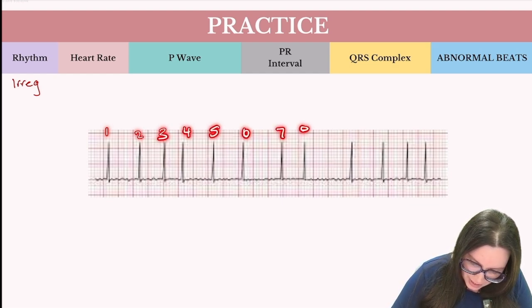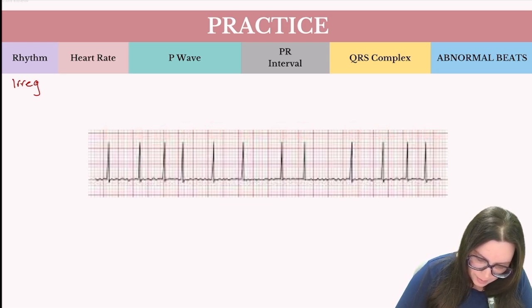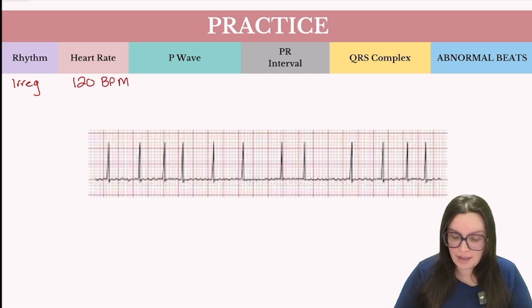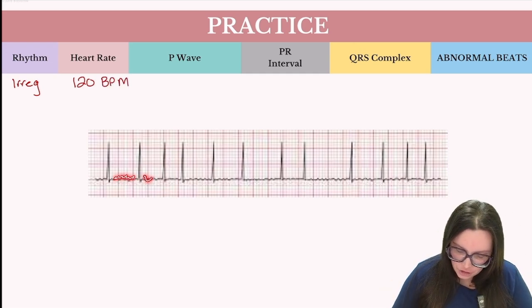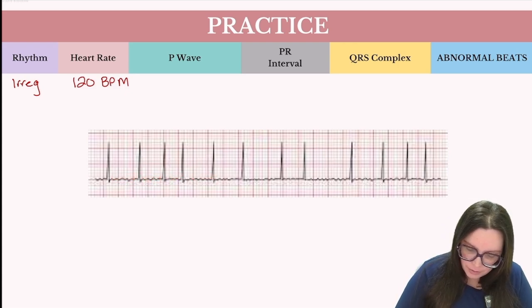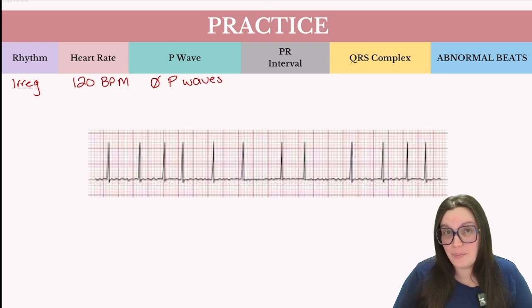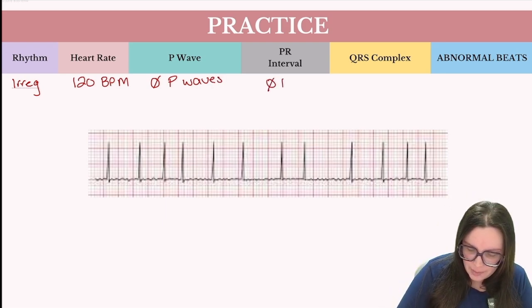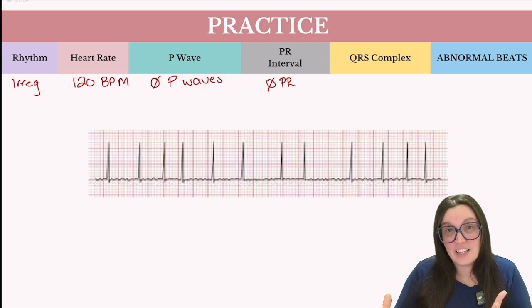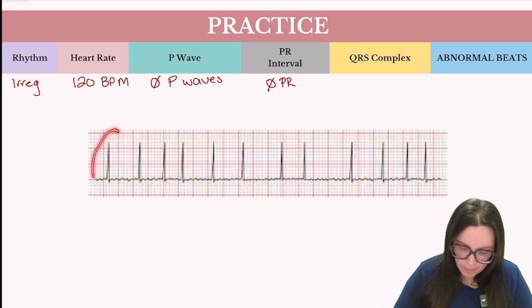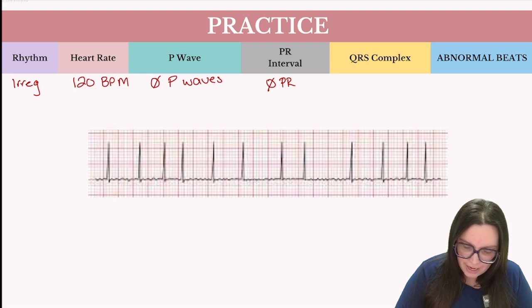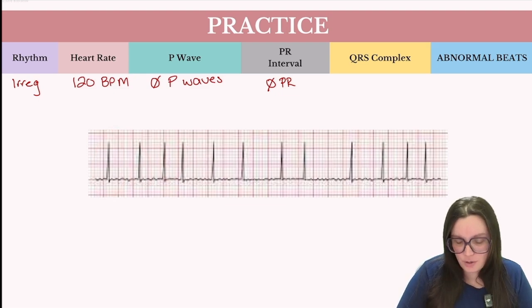So we have a total of 12 QRS complexes, meaning a heart rate of 120 beats per minute. Next, do we have any identical P waves? As you can see here, we just have these fibrillatory lines, so absolutely we do not have any P waves we are able to measure. Because we don't have P waves, we also don't have a PR interval. Looking at our QRS complexes, they are very, very narrow — less than 0.12 seconds. And there are no abnormal beats.